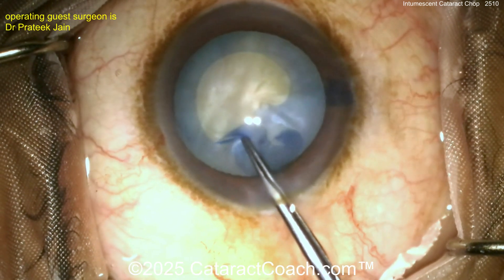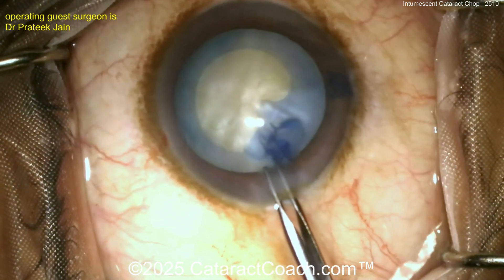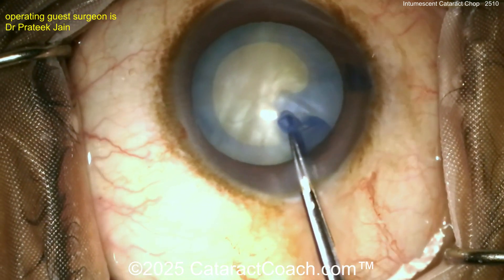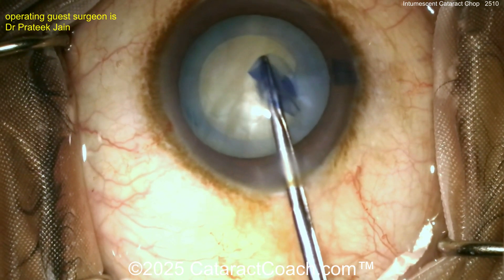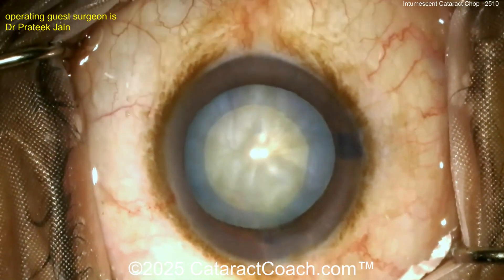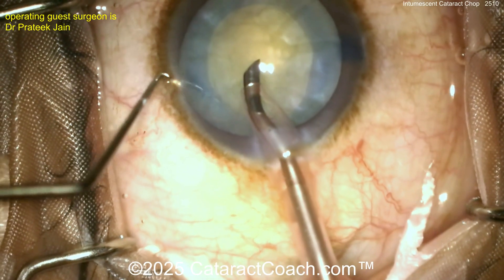Now the nucleus removal is going to be the fun part. Again, remember my favorite of all is a white cataract — that's part of the reason I went into ophthalmology. When I was a young medical student I saw a white cataract being done and I was amazed. What an amazing procedure, and now how many years later I still love it. That's a beautiful looking rhexis, by the way.